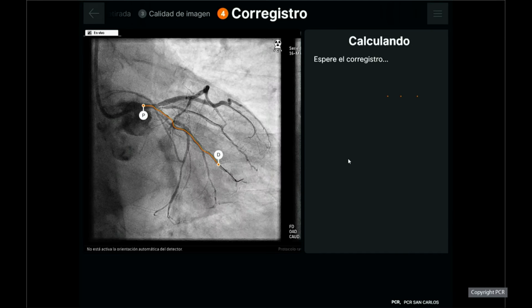If we go back, you remember that in the initial pullback we had assessed this as the possible potential distal landing zone. Yeah, can we keep the OCT on the big screen? OCT on the big screen? Yeah, this is what we're interested in now.